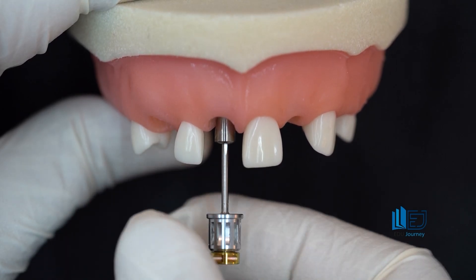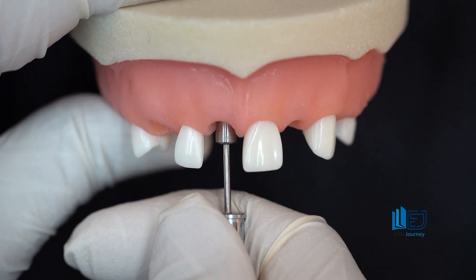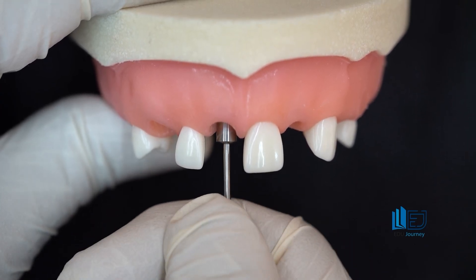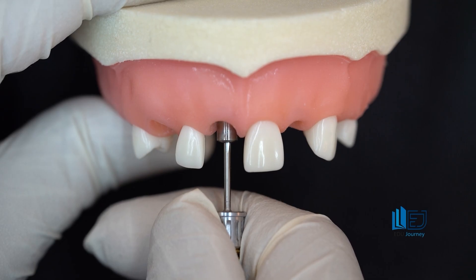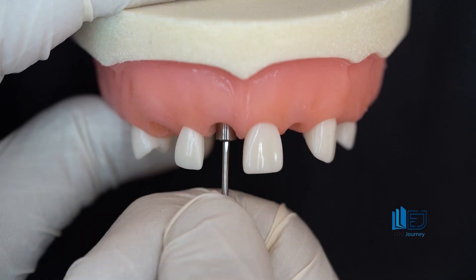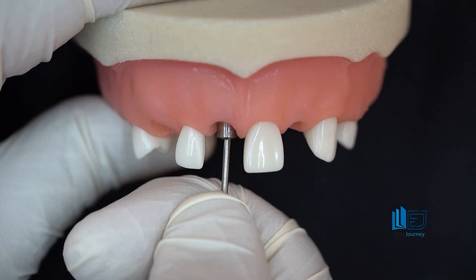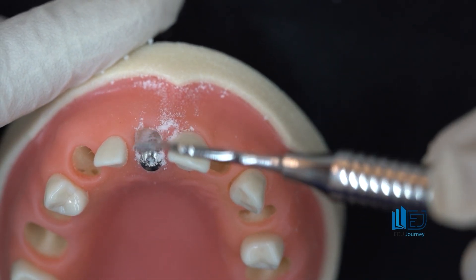I'm using a hex driver or a healing abutment wrench to tighten the healing abutment. Unlike uncovering surgery where we always recommend using a healing abutment two to four millimeters above the free gingival margin, in one-stage surgery it's not necessary to use tall healing abutments, because functional forces and chewing might cause the healing abutment to move and also move the fixture. So in a one-stage surgery, if insertion torque and primary stability are good, a short healing abutment that's flush with the gum is enough. Later, with tissue shrinkage, the healing abutment will appear more prominent above the gum and you won't lose track of it.